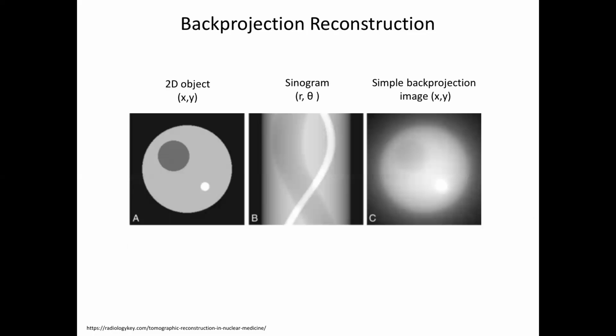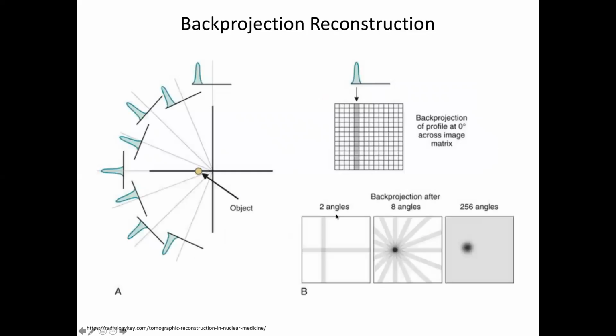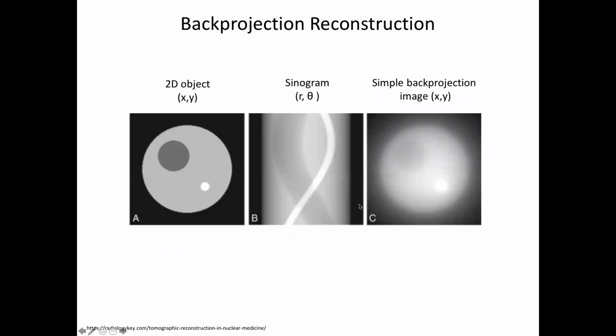And this is from the lecture on Tuesday. If we look at this object and we stack these functions, I'm just going to stack them as a function of changing theta, and look at that 2-dimensional function. I get this thing, and this is called a sinogram. So theta is changing as I go in this direction, and this direction is position along the detector.